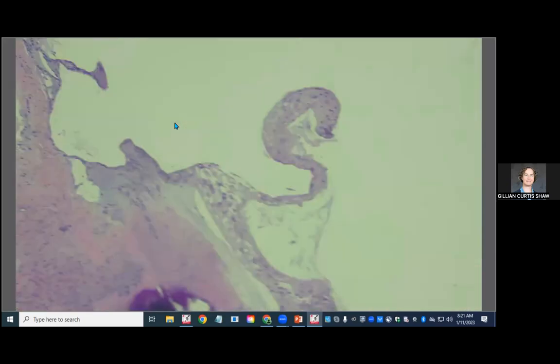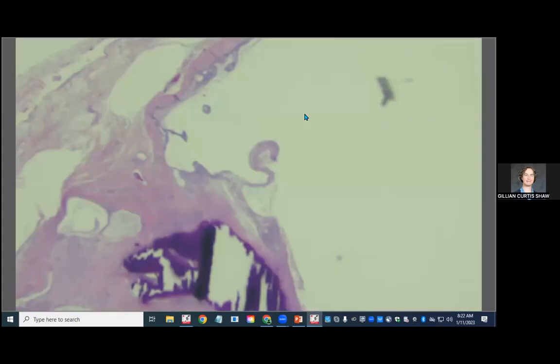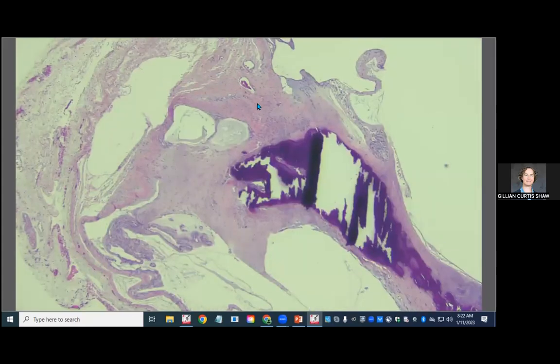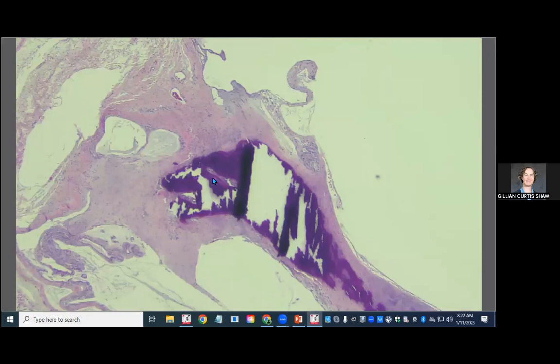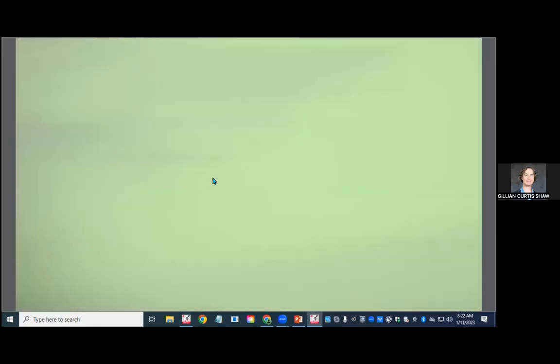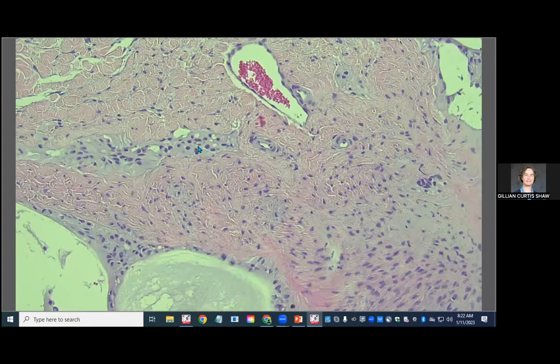And eventually we get something right here that's kind of retina-like, but no distinct and well-organized retinal layers. It's just sort of a glial scar or a little tag of retinal-like tissue. The outpouching is interrupted by this big mesenchymal focus of tissue, which is that white tissue we saw on gross view. And on histologic view, it's got bone in it. So here's bone through here. It's got fibrous tissue. It's got fibroblasts. On occasion, it has these little rests of nervous-like tissue. They look like maybe astrocytes or something through there. So it's all this kind of disorganized mesenchymal tissue.